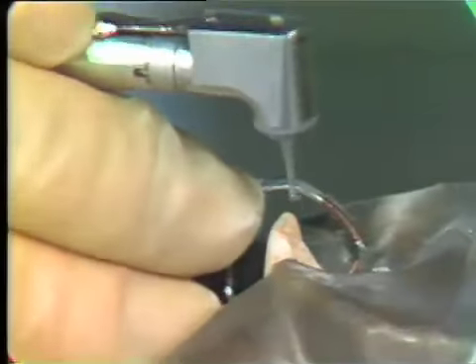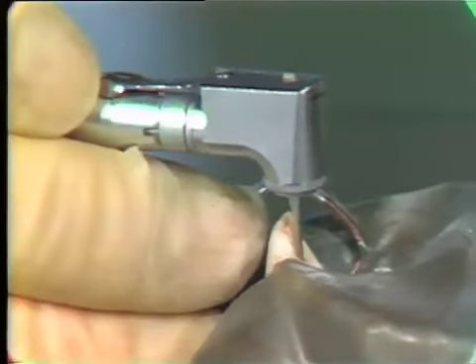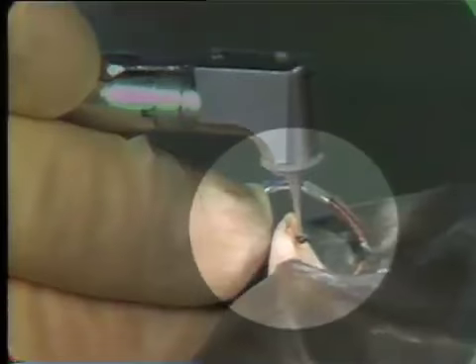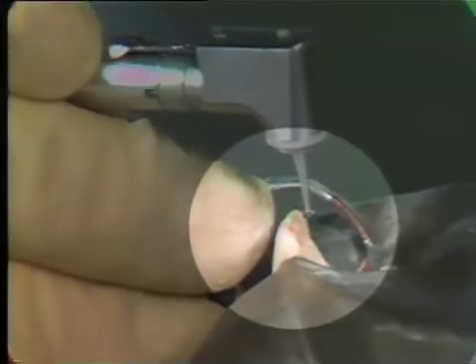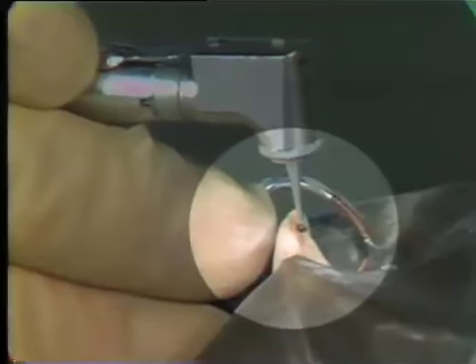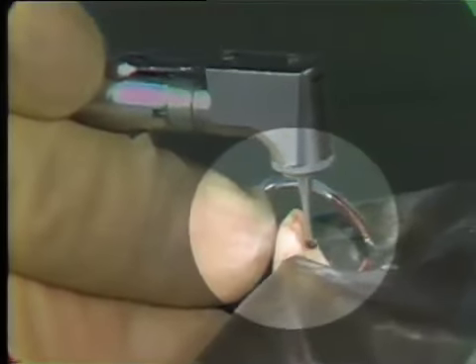As we said before, the next step is to get access to the pulp chamber. With the low-speed handpiece angled in the long axis of the tooth, visualize where the long axis of the tooth is. You start the handpiece and go directly to the pulp. You're not looking for the pulp. You should know where it is, and you go directly to it.